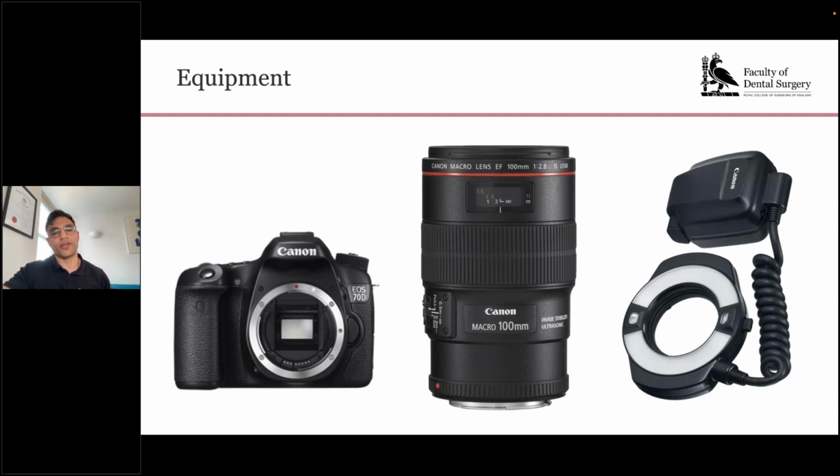And I personally prefer Canon, but my piece of advice would be, if you're going to buy from one manufacturer, you should try and make sure that all three of these components are from the same manufacturer, because they talk to each other in one way or another, and it means you get better quality photographs. I would avoid mixing and matching, because the end result doesn't tend to be as good.